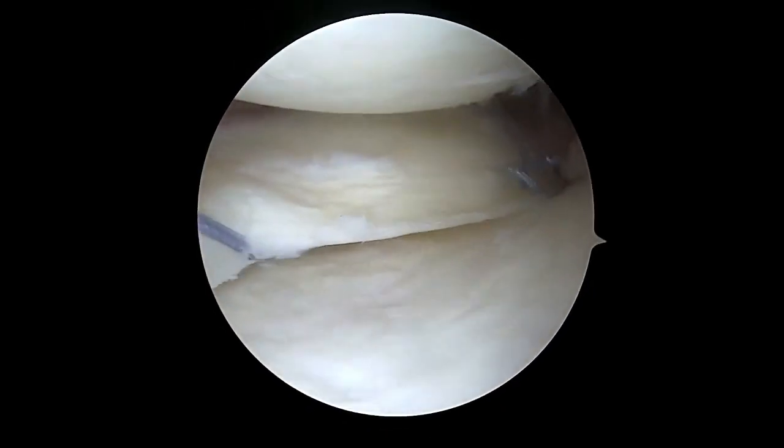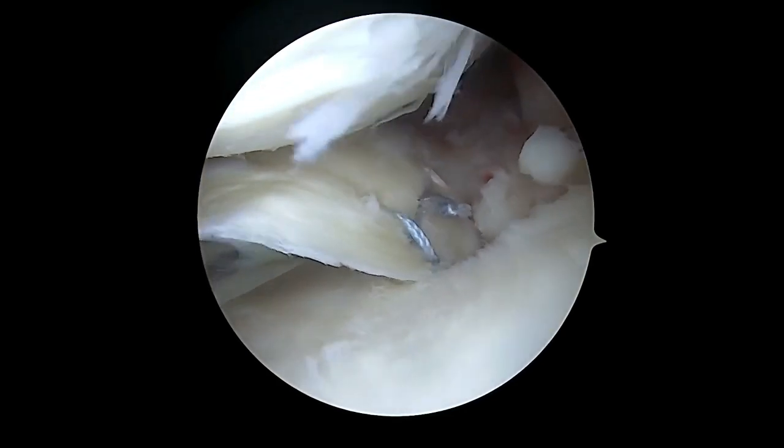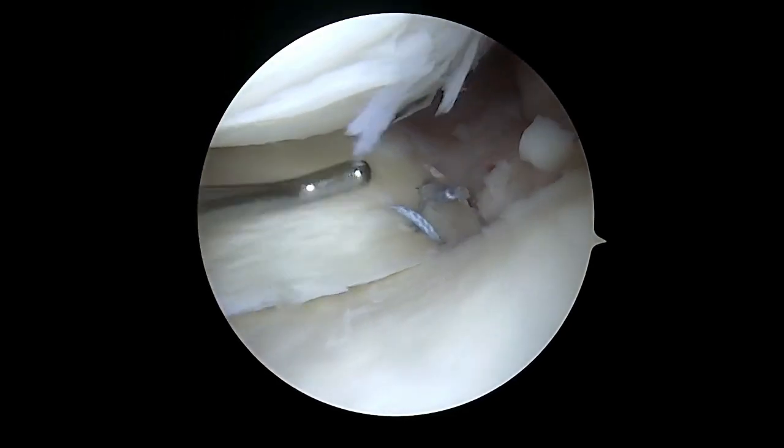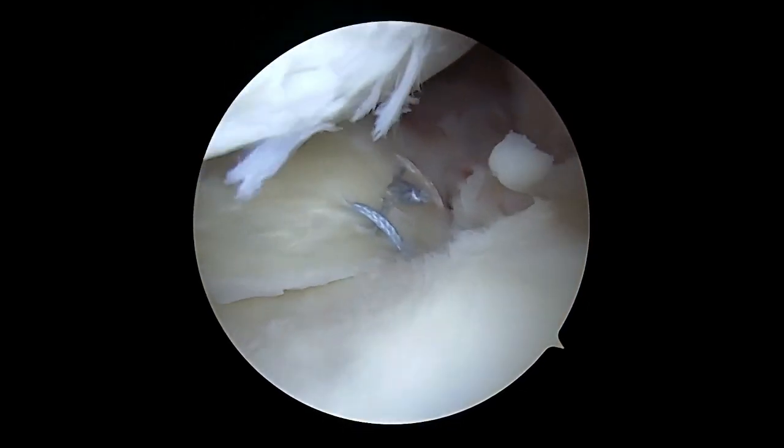We then return to our tibial anchor repair stitch for the centralization and re-tension the knotless mechanism maximally. This creates the final construct for root repair and centralization, which is stable to probing.